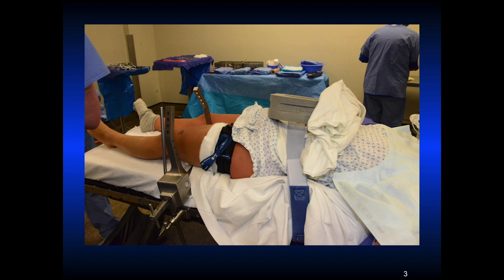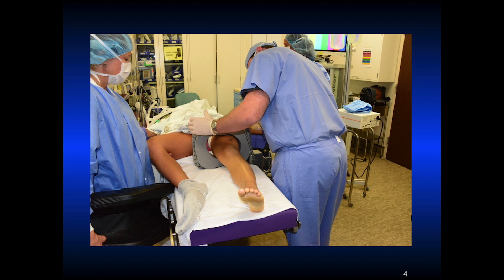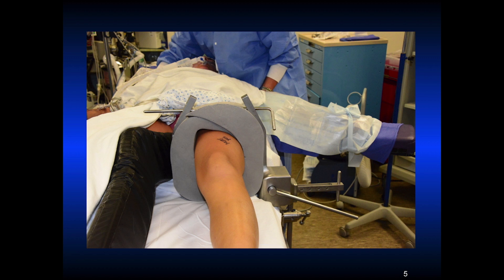The reason we want it low down, particularly in a varus knee, is that if you don't have it five finger breadths below, it'll be hard to open up your medial compartment into valgus because of the lever arm. This is applying the soft foam cushion that goes around the leg. Sometimes a little higher up if you're going to have to do a suprapatellar portal or patellofemoral work. You want it pretty low — five finger breadths — if you have a varus alignment, because it'll be difficult to get into valgus enough without injuring the articular cartilage of the medial compartment. Then the leg holder is tightened and the bar placed. It needs to be tight enough to provide the clamp effect but not too tight to cause a lot of bruising.